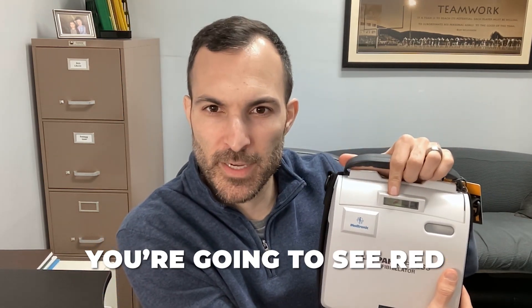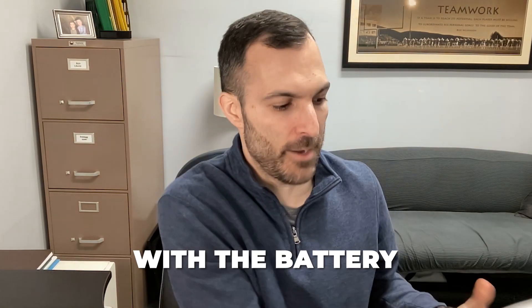When you're taking a look at a device that is no longer registered, compliant, or good to go — for example, here with the LifePak Express — you're going to see red. It's kind of difficult to see here, but when you take a look, you can see the red battery light.